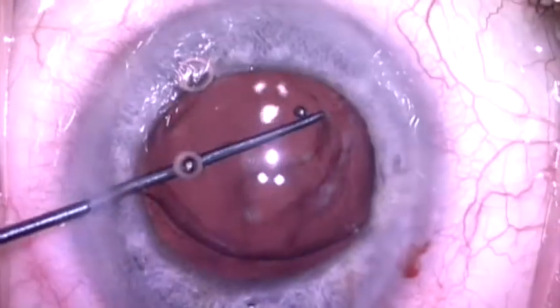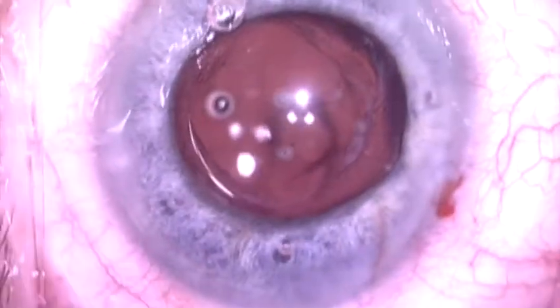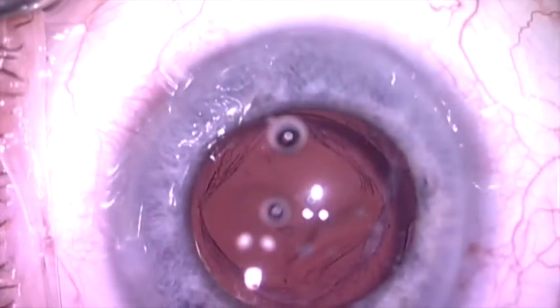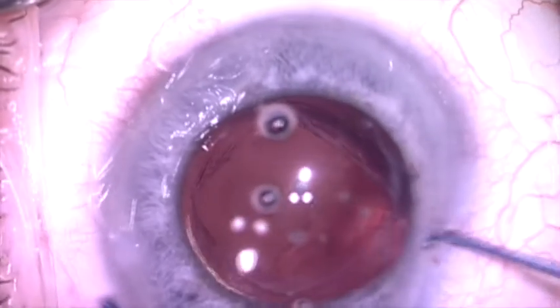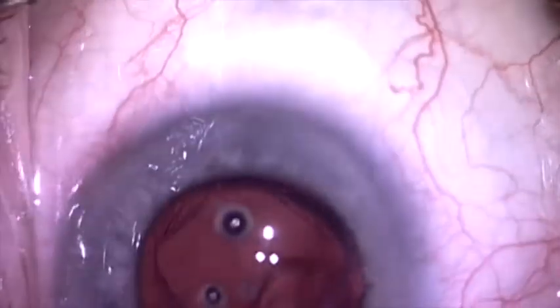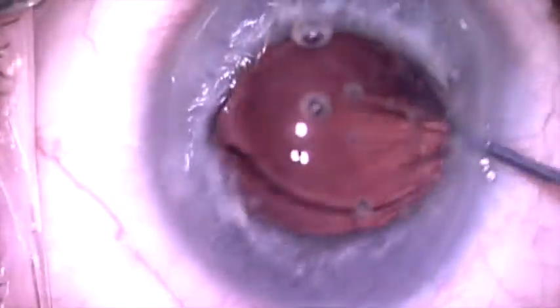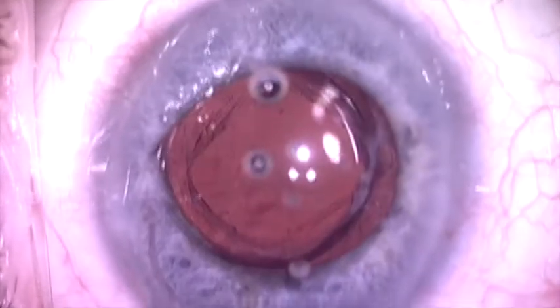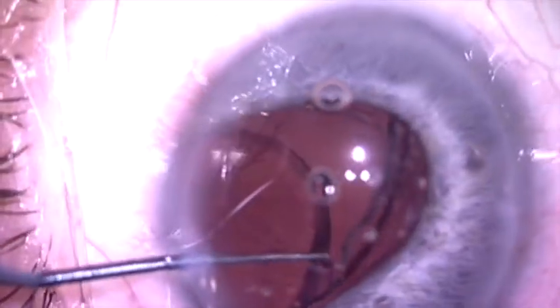At this point, I felt that I could have been pretty much finished with this case, but I did recall that the lens in the patient's eye was a little bit underpowered and would have left the patient slightly hyperopic. So after discussing the situation with the patient, she decided that she would prefer if I took this lens out and put a higher power lens in, and we went ahead and did that.